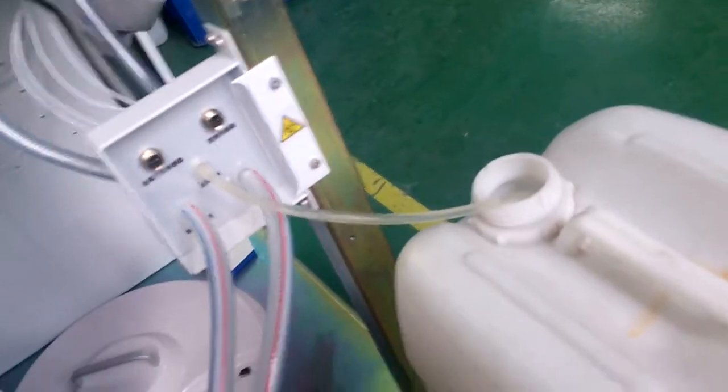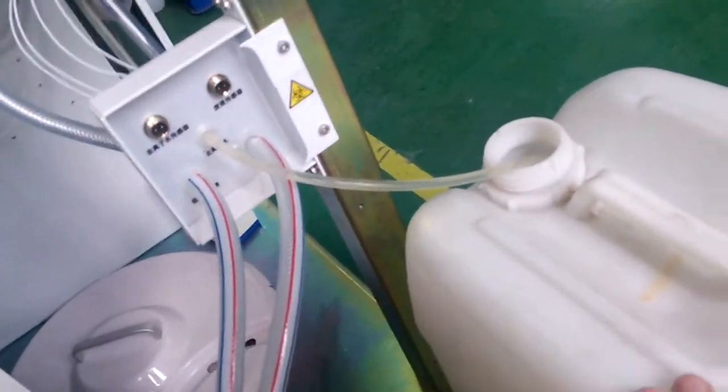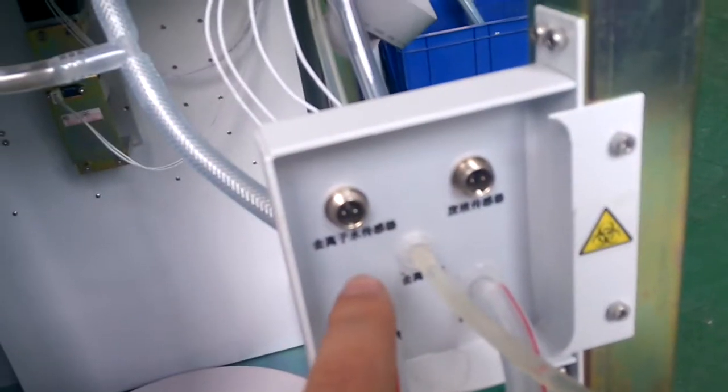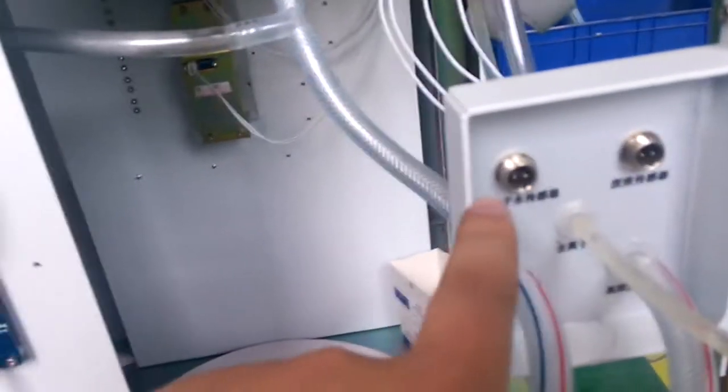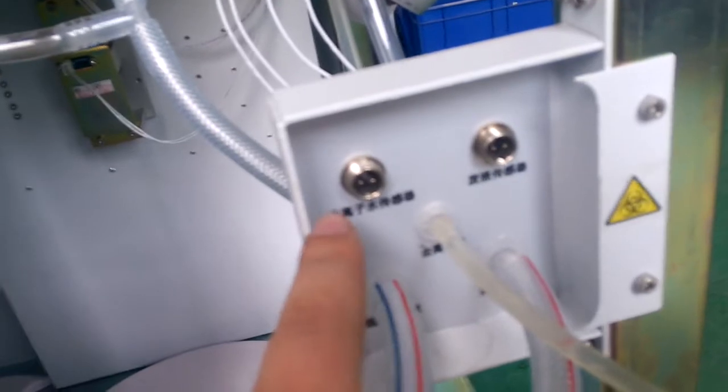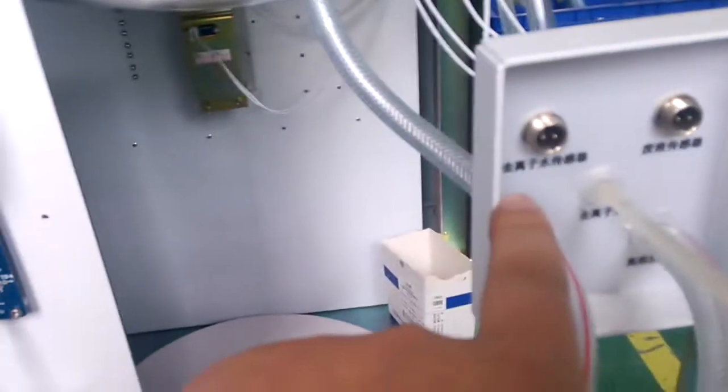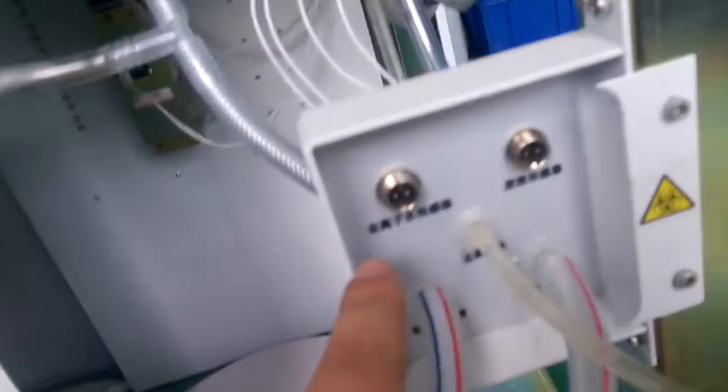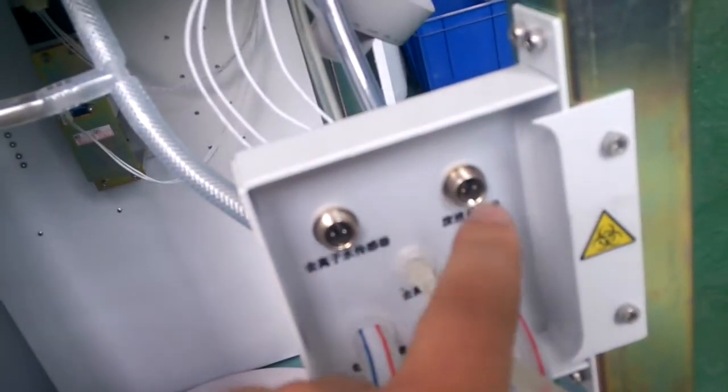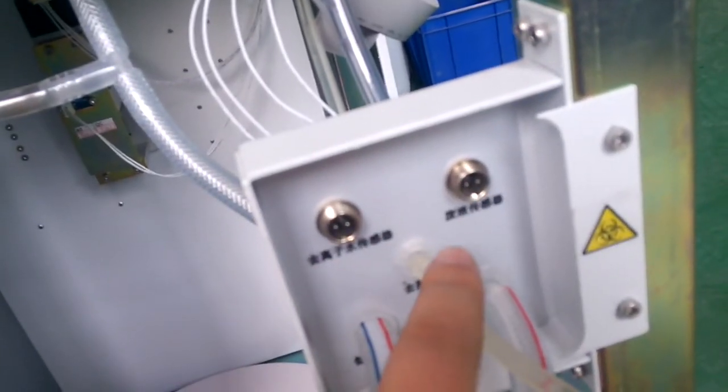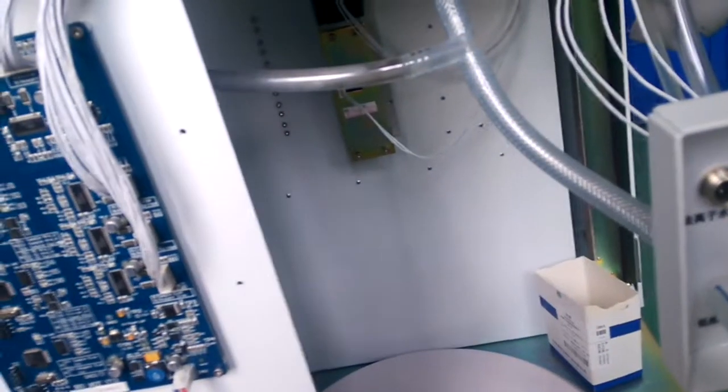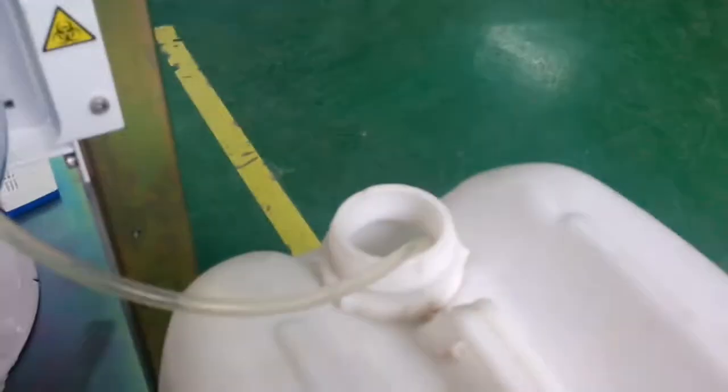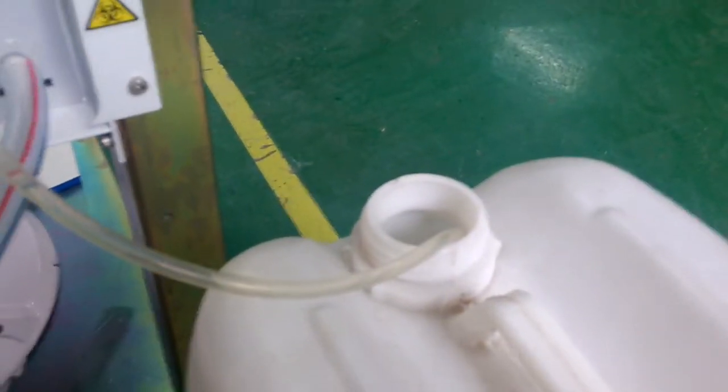There are two tanks. One for wastewater and one for DI water. You can find this connector. This is for DI water liquid sensor. This is wastewater liquid sensor. This is the DI water intake. Intake from DI water tank.